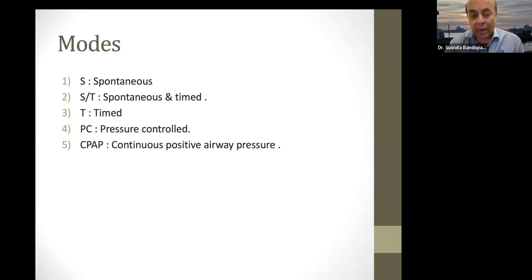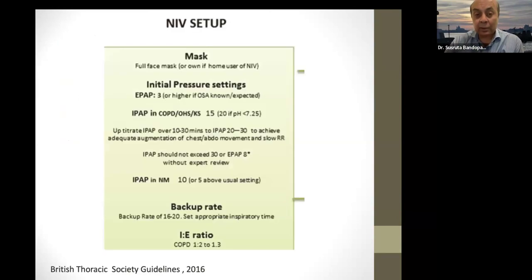And now we also have a pressure control mode, which not only supports and gives an extra pressure during inspiration, IPAP, but also decides the amount of time for which the IPAP should be given, so there is an inspiratory time.